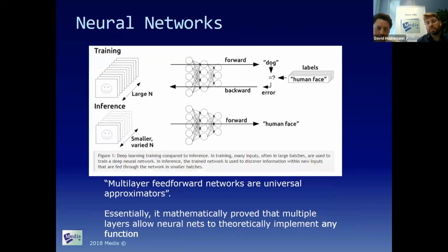The way such a network learns is by what's called backpropagation. You start with your images on the left, which are just your pictures. You run them through this network, which initially starts off randomly connected and set up, and you get some answer from the network in the final output.